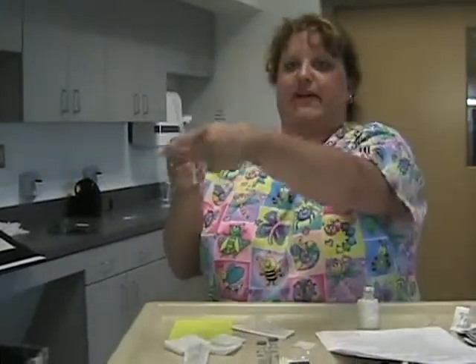There is a safety feature here on this needle. Since this was the needle that you drew up with, you're not going to go and give this to the patient. Plus, it's a larger gauge, or in some facilities, it would be a filter needle. So you go ahead and take your thumb and provide the safe lock so you or your patient does not get stuck. Then we want to go ahead and change our needle, so we keep this one clean.